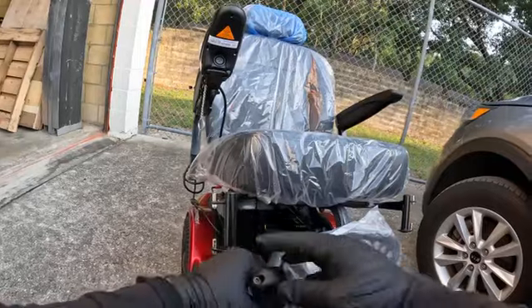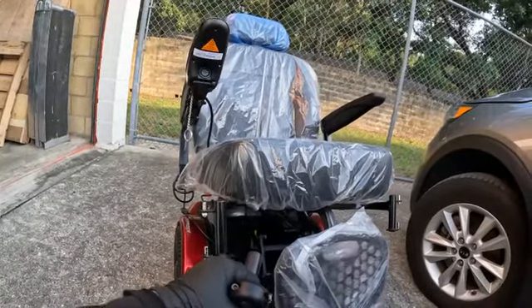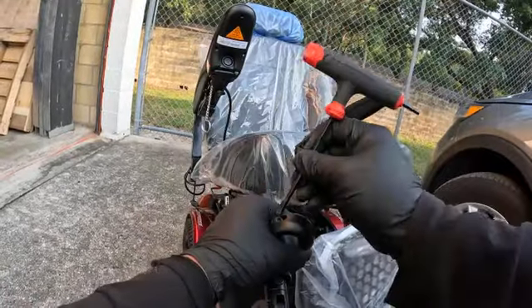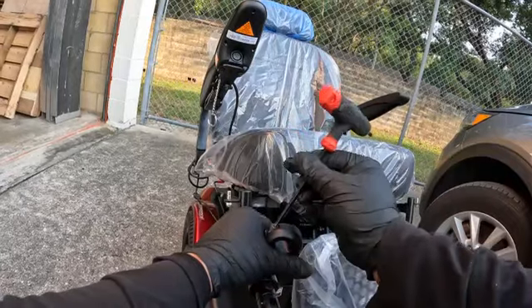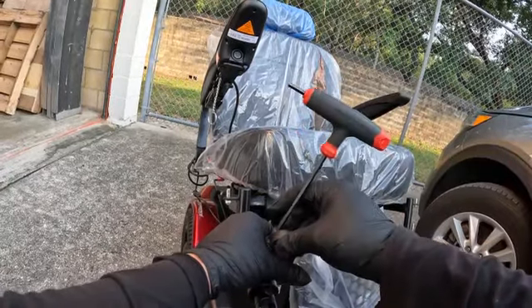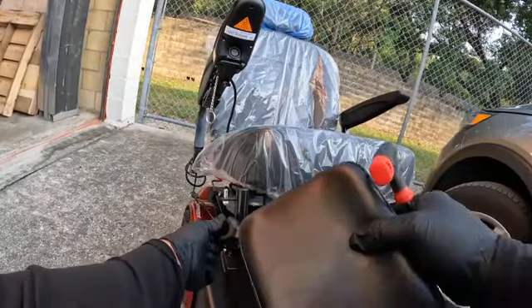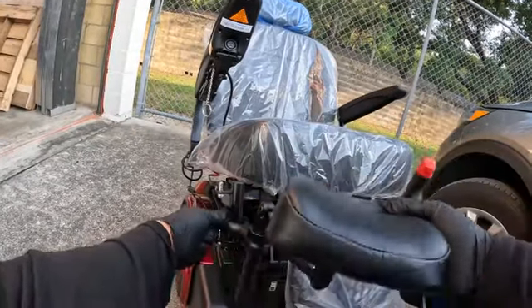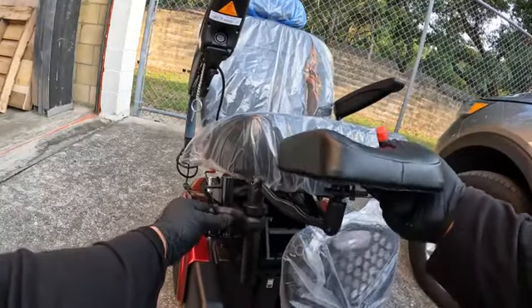It looks like I'm going to have to loosen that one up too, so let's loosen that up. You don't need to take it all the way off, just loose enough to where it opens up a little bit. There we go — perfect. Once you have that, you're going to bring it as high as possible.